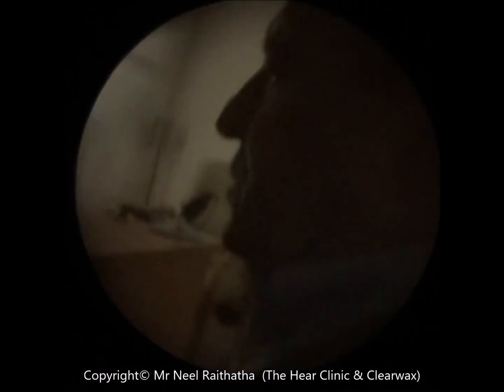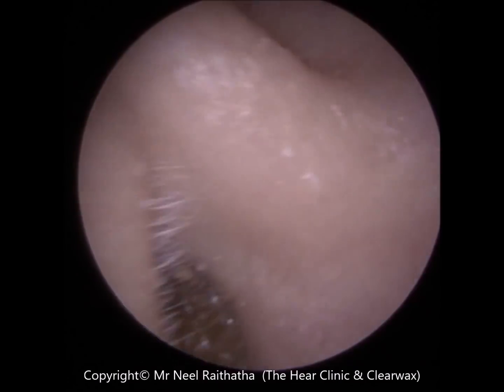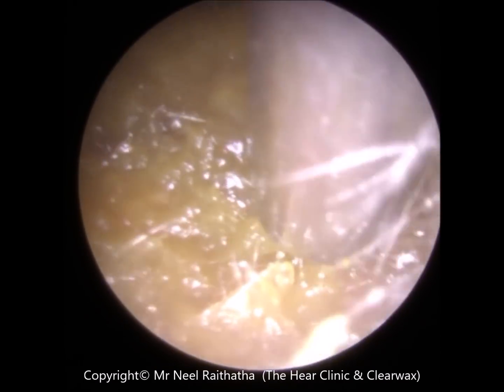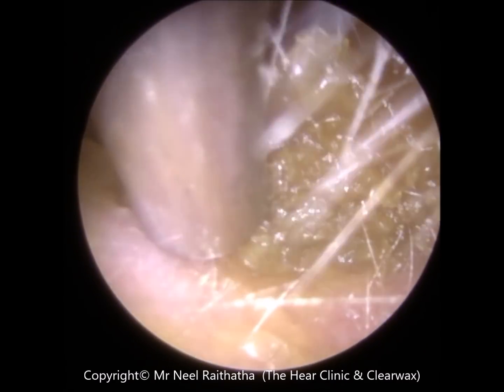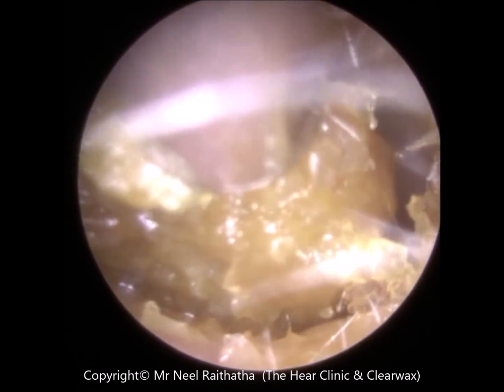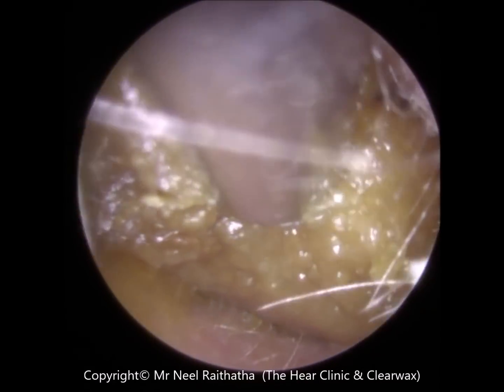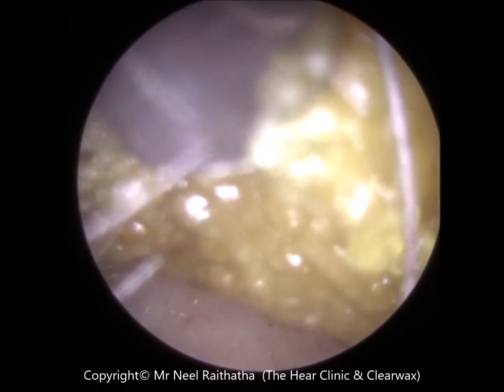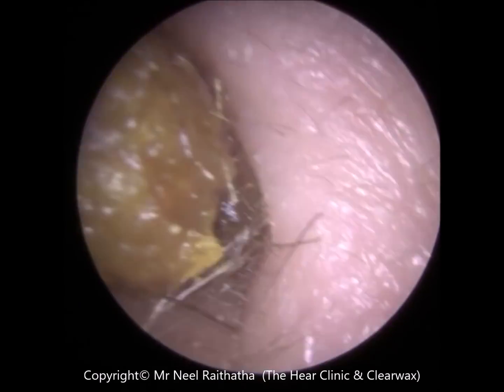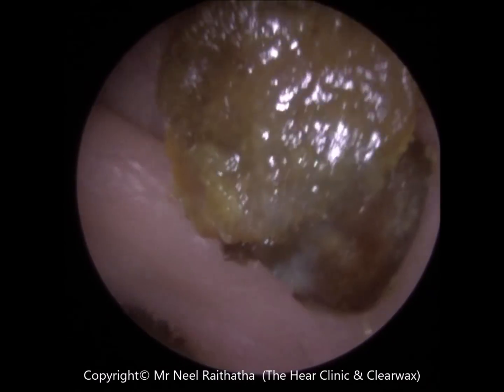I'm going to start off with some suction; I might need to use some other instruments as well. I'll try and get this out in one go. I've got a bit of suction. That's the huge plug of wax there.